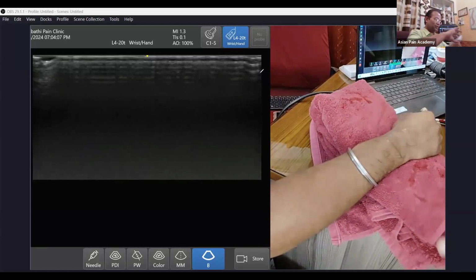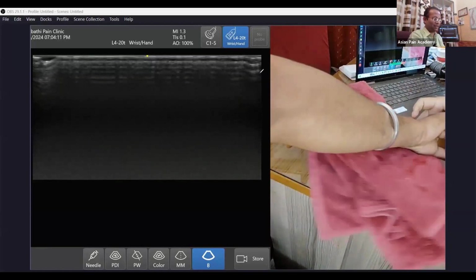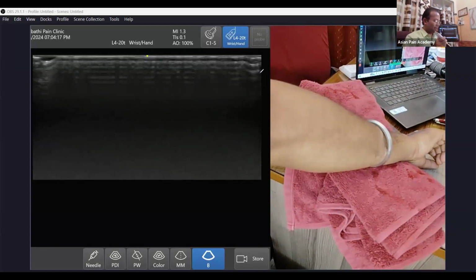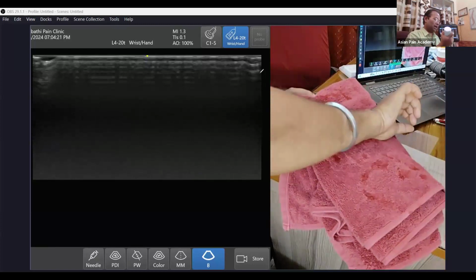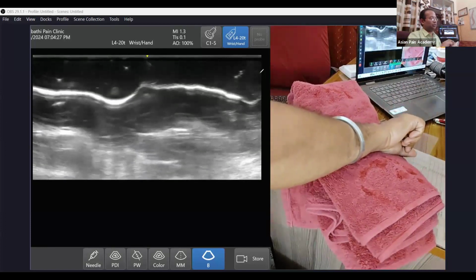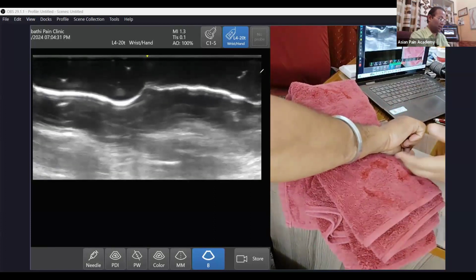Oh, TFCC. I have not shown you the TFCC. So the last thing from my side is TFCC. But anything else you want to see, I will show, and I will ask you some questions also. Let's see how much you can memorize, because a few things you must memorize. There is no other option, like which compartment has which tendon.